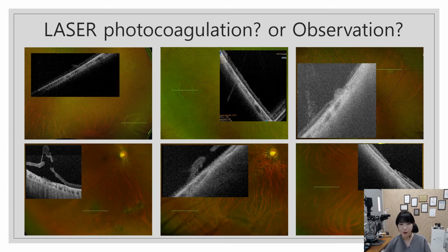What is your score? Even for a trained retina surgeon, the decision is not always easy. You may do the laser for every patient with suspicious lesions, but unnecessary laser may cause new retinal breaks in adjacent area. But now we have a solid proof for the laser photocoagulation with the ultrawide field OCT.